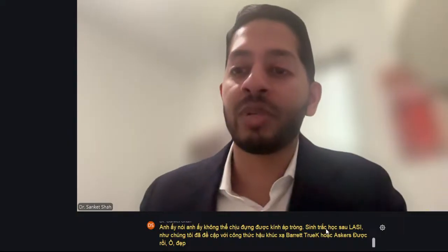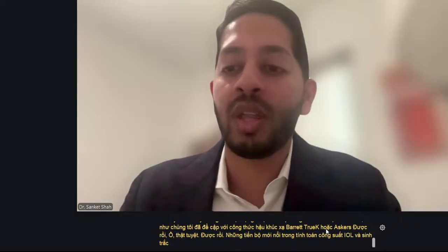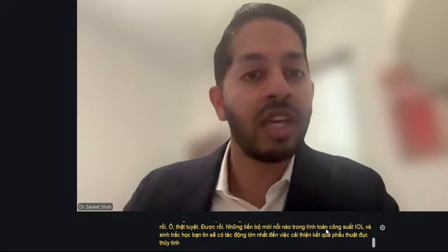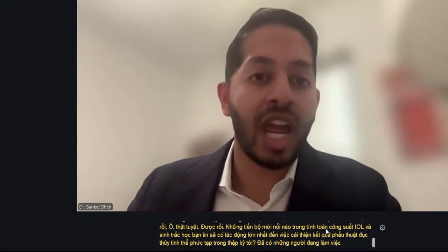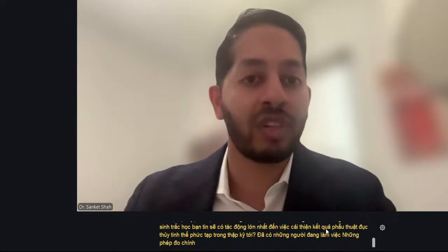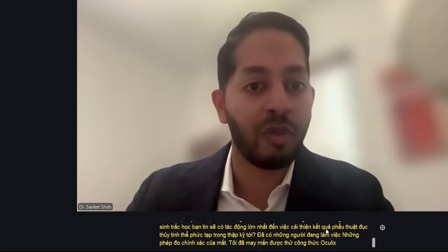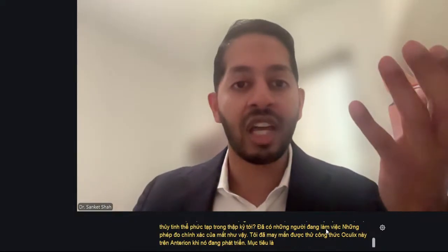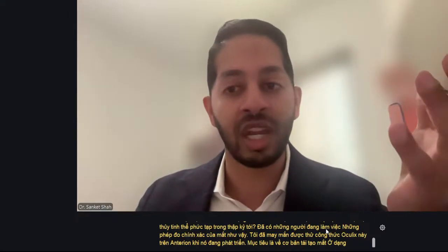What emerging advancements in IOL power calculation and biometry do you believe will have the greatest impact on improving outcomes in complex cataract surgery over the next decade? There are already people working on such accurate measurements of the eye. I've been fortunate enough to try out this Okulix formula on the Anterion as it's been moving forward. The goal is to essentially recreate the eye in a computerized form with the amount of data we can obtain.